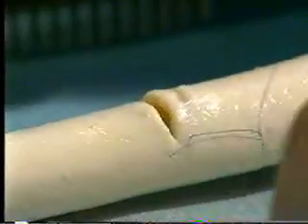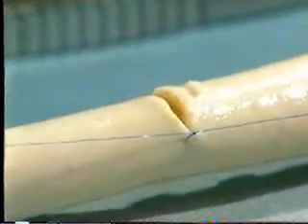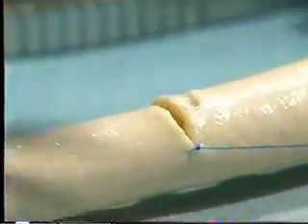Tie the suture and ensure that each throw of the knot is laid as a proper reef knot, remembering that several throws are required. Then secure it in a rubber shod hemostat.